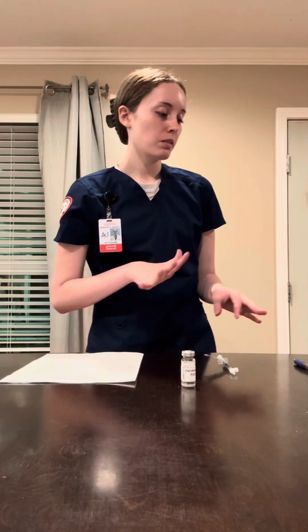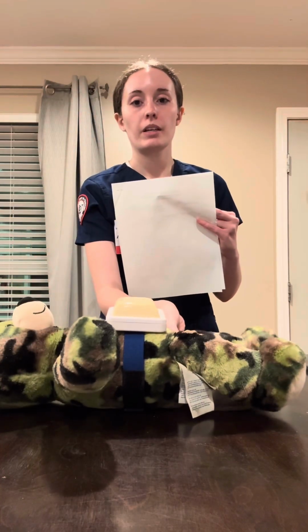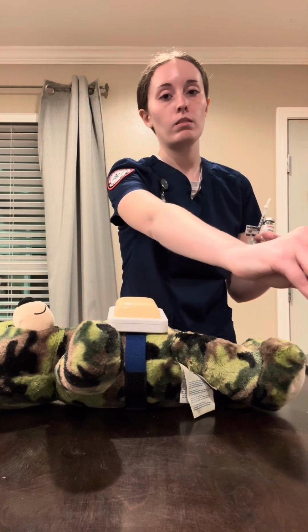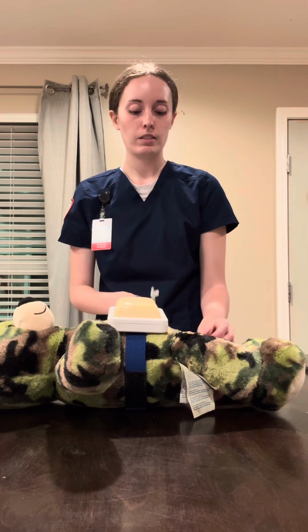So I would grab all of my supplies: my alcohol swab, my medication in the syringe, the vial, and then the MAR. I'm just going to bring the patient around here. I'm going to set the MAR right here. This is my sharps container, by the way. And place the vial and stuff right here.